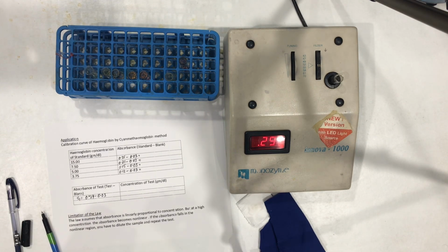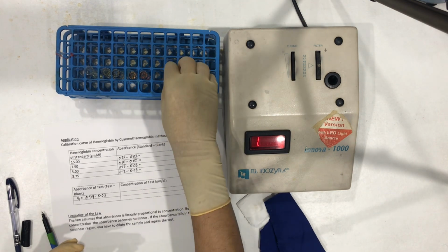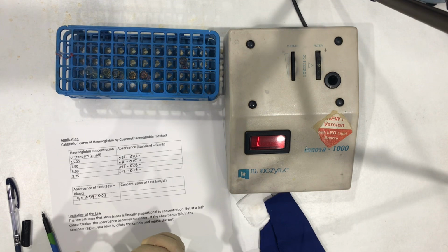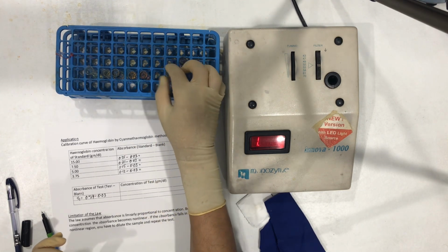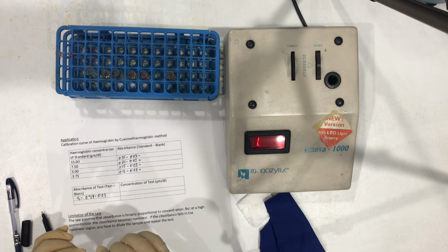Now let us take the absorbance of our second sample, S2.